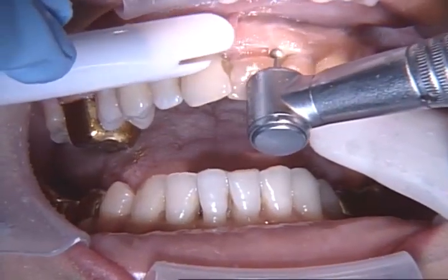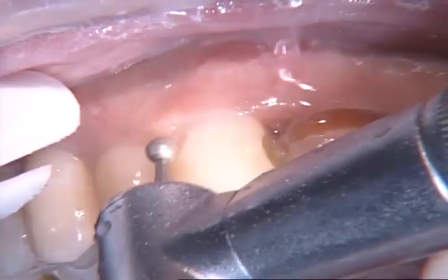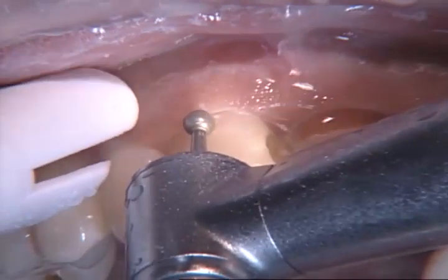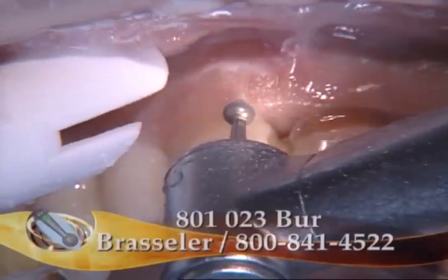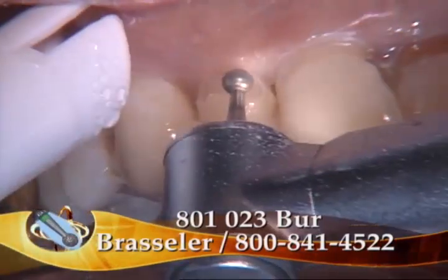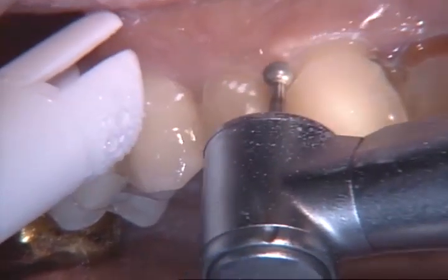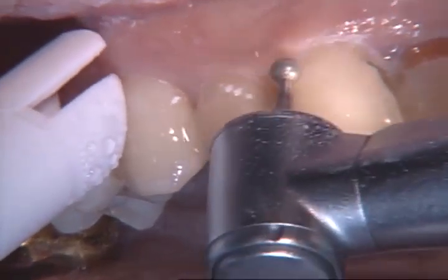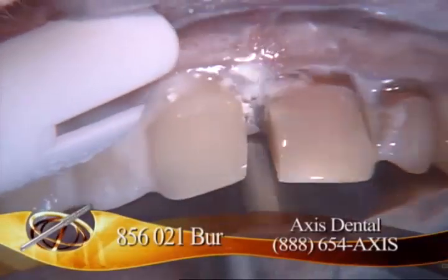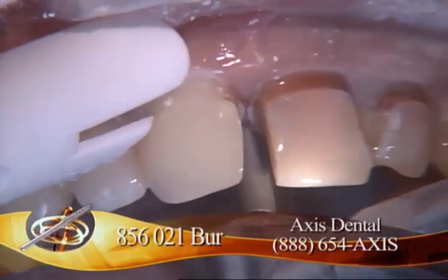And even when we're doing caries control, we'll typically start with the reverse preparation technique, because I know I'm going to have to get some temporaries on at this appointment anyway. So we start with the 801-023 round burr and go ahead and make our gingival depth cut on the facial of these teeth. Again, as we do this, it creates a perfect half circle in the gingival third of the tooth, so that as we do our axial reduction, we'll end up with a perfect margin. Here's our 856-021 burr being used, taken right down in between those two at the same time.